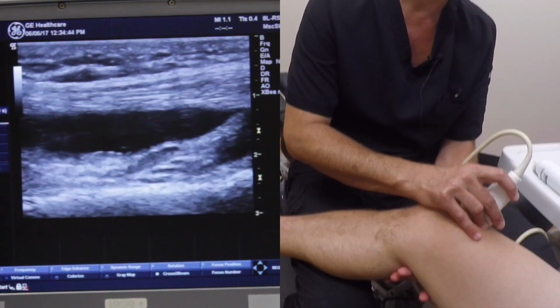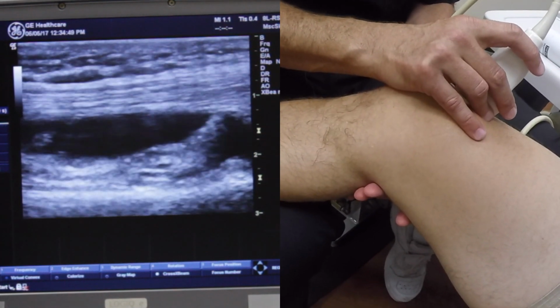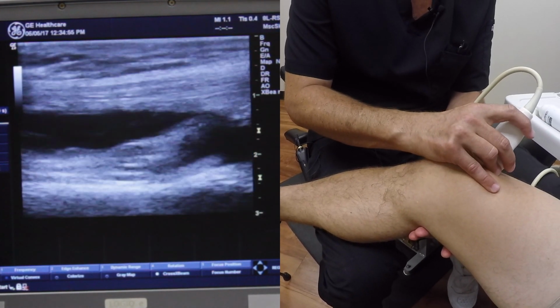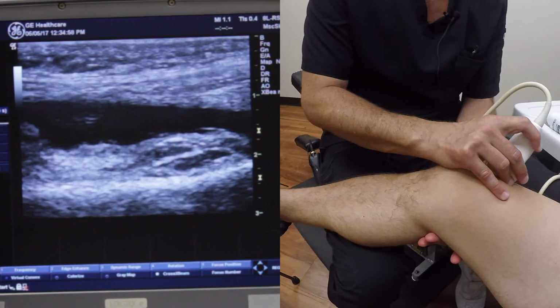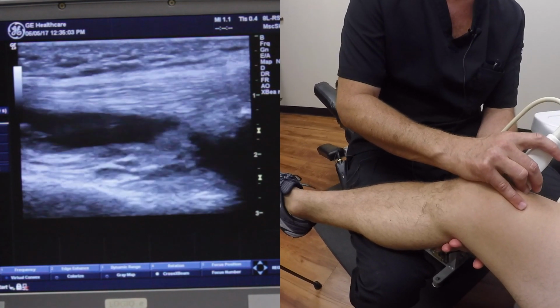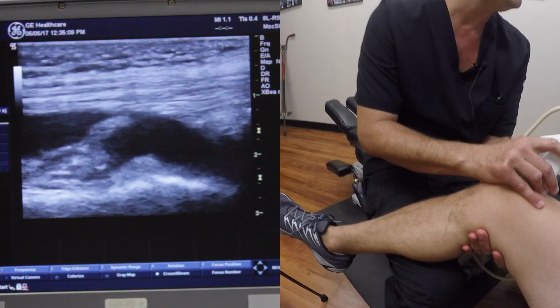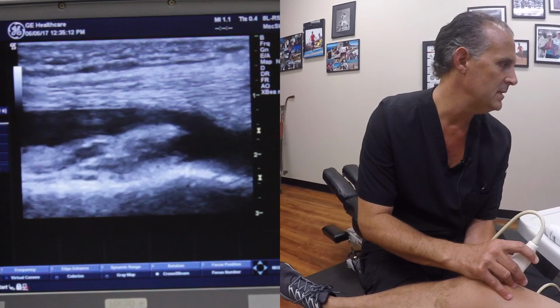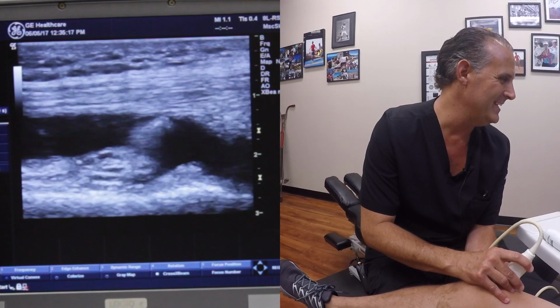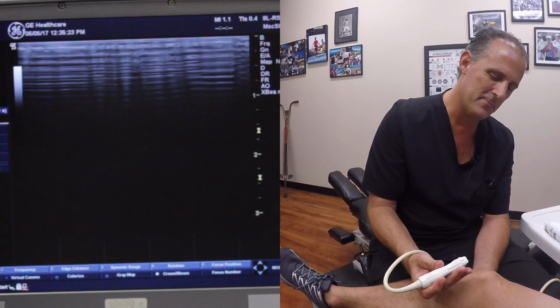And in our orthopedic center that we work in, they would drain this if they were going to do a knee injection. They would probably aspirate that first. So how on a normal knee then would we see that black at all, or would you see just less of it? You'd see a little trace of some joint fluid and there's a little suprapatellar fat up there. There's a little area of fat that sometimes has a darkened, hypoechoic is the term we would use, appearance. But this is definitely not something that you should see on the average patient. So there's some reason going on here.